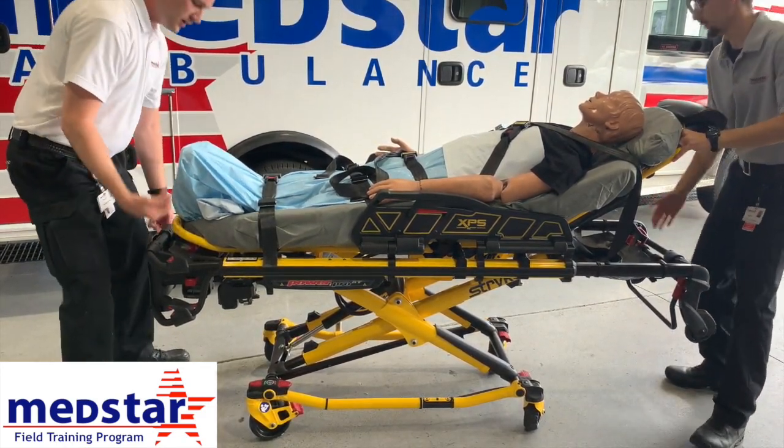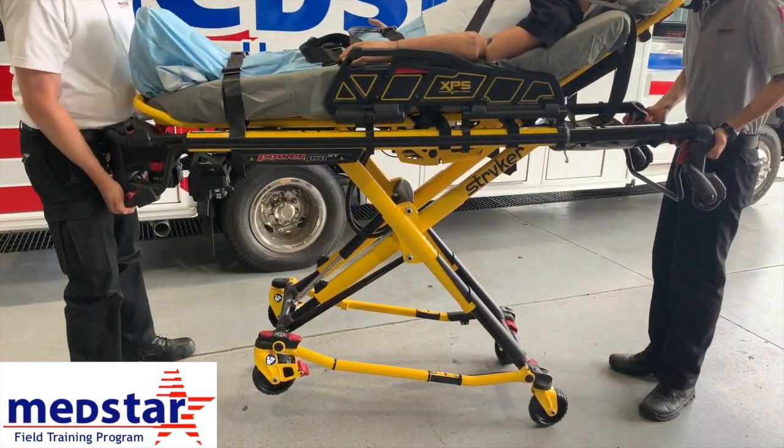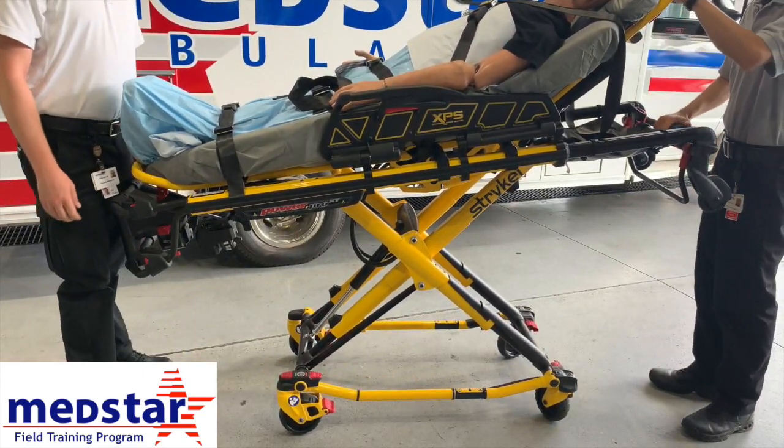To raise back up, do the same thing: take the weight off, squeeze the trigger, and go up nice and slow. The legs will come down a little slower because they are hydraulic. Release the trigger and it will settle and latch in place.